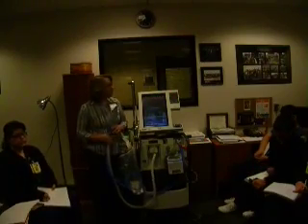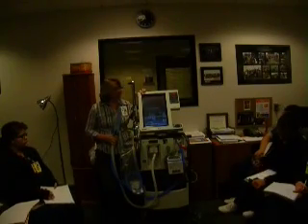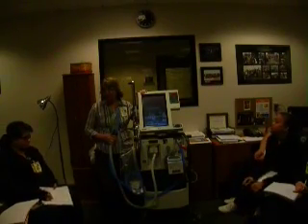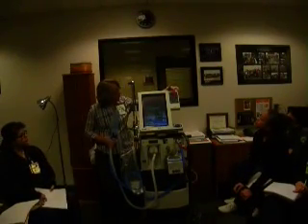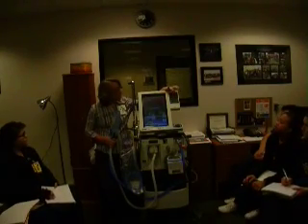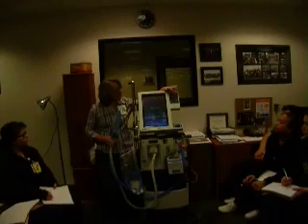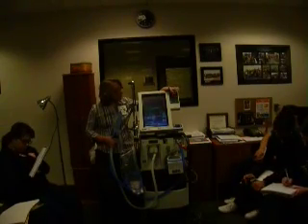I don't think I'm going to be able to simulate the other alarms because we have an O2 alarm, and as long as that's going, you're going to get a high priority. But when we can hook it up in the class back up with oxygen, I'll show you the difference. Over here to the left, there's a top one, then a middle one, and then a bottom one. So depending on which alarm, it will light up differently. This is more like an orange, and this is more like a yellow. So high priority, medium priority, low.